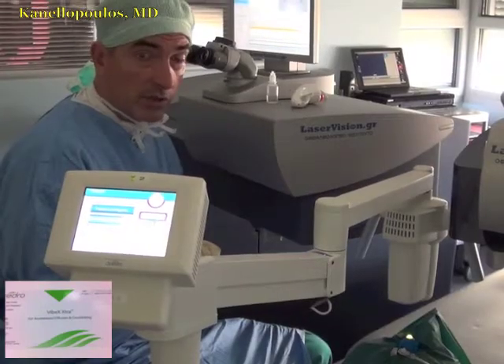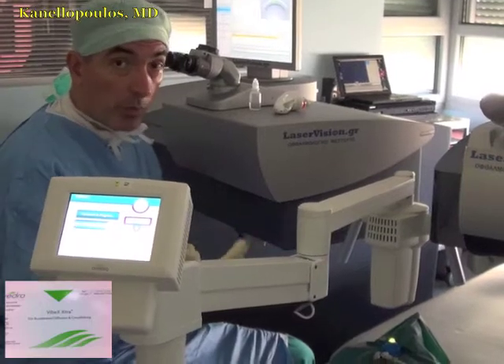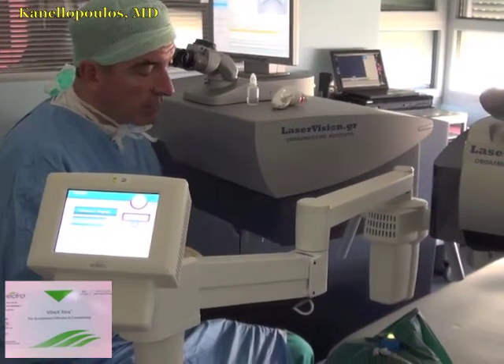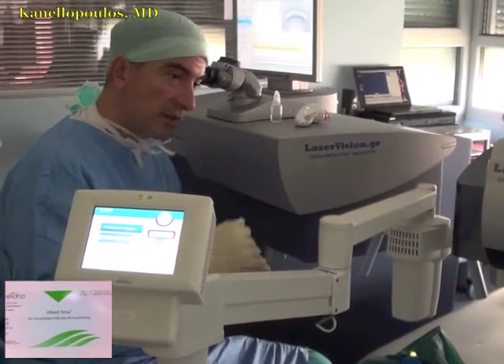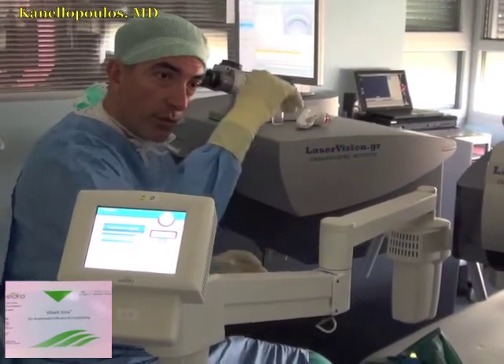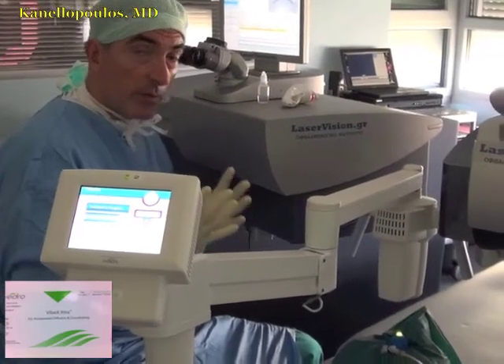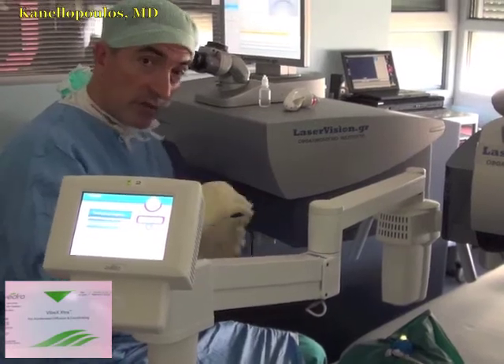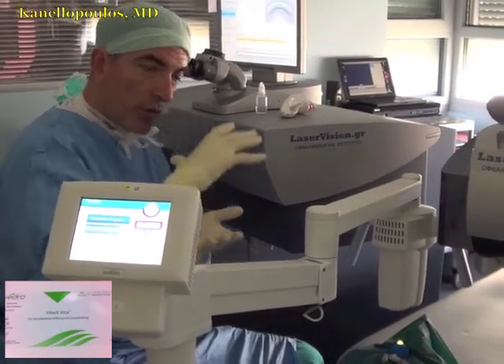This is a higher concentration of riboflavin — 0.25% versus 0.1%, which is the classic dextran-based riboflavin. In essence, what we're trying to do is have UV light go through the translucent cornea that is not soaked with riboflavin, reach the pocket, which now has diffused riboflavin over and under it.